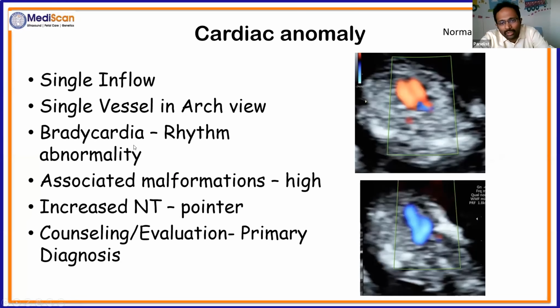Then we move on to little complex problems like the heart abnormality. In the 12-week assessment, you have to look for the presence of the heart of the baby on the left side and two cardiac inflows and two cardiac outflows, what we call the arches. This assessment of the heart of the baby is a basic evaluation at this point of time. So we are not trying to detect complex heart problems, but we're only trying to detect major problems like a baby having an absence of one inflow or an absence of another inflow.